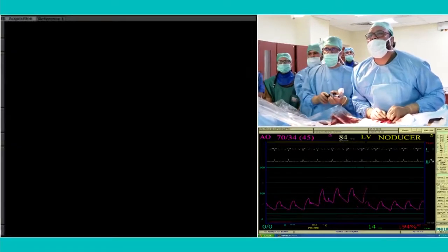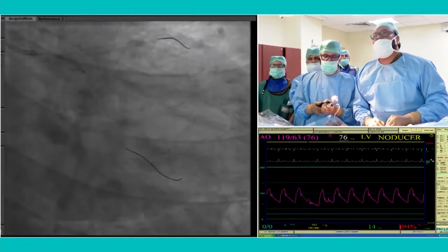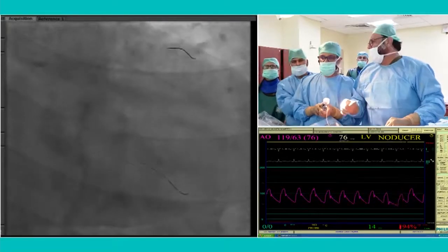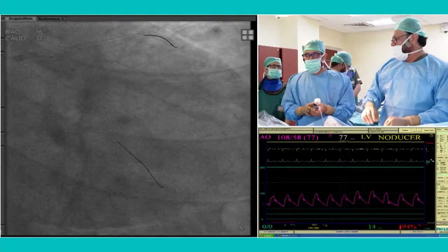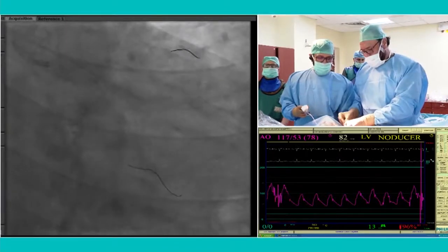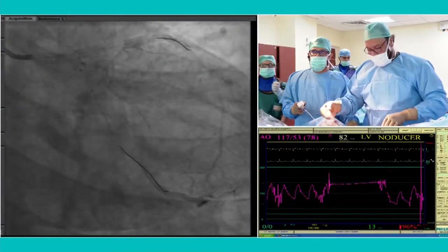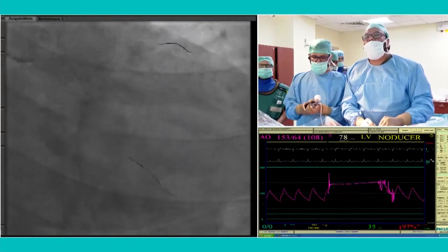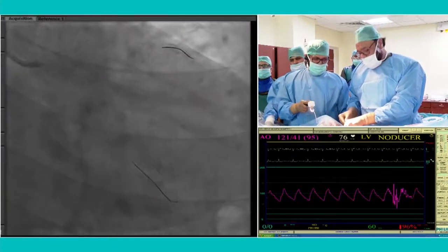Are we okay? A 2.0 balloon, open the struts a bit. Going up, sir. What size of balloon have you taken? This is a 2 millimeter balloon. Give me a 2.5 for the pre-dilatation of the lesion. Yeah, we're good with that. Going at high pressure, sir. 14 and 16. So we're just pre-dilating the proximal circumflex lesion.